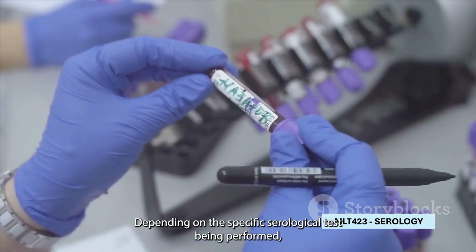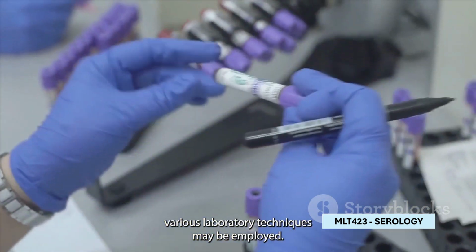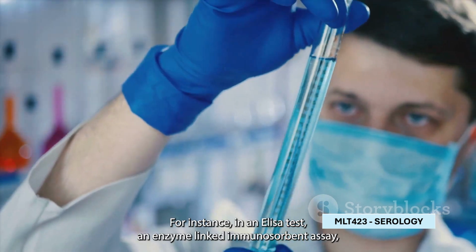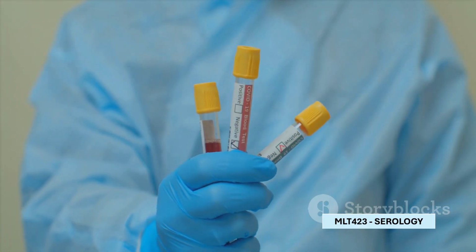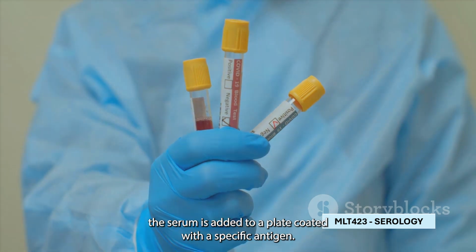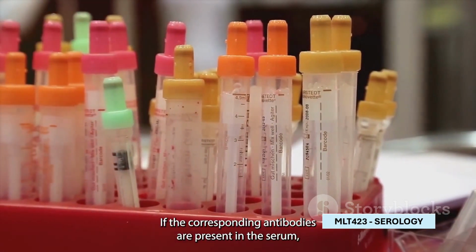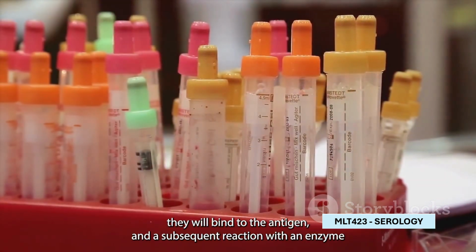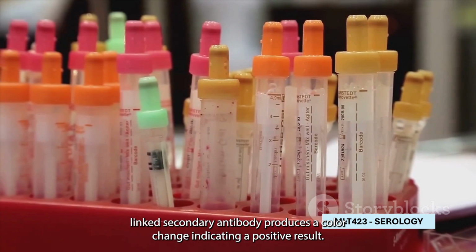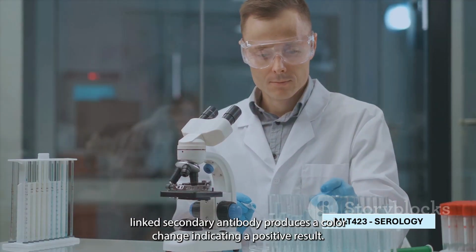Depending on the specific serological test being performed, various laboratory techniques may be employed. For instance, in an ELISA test, an enzyme-linked immunosorbent assay, the serum is added to a plate coated with a specific antigen. If the corresponding antibodies are present in the serum, they will bind to the antigen, and a subsequent reaction with an enzyme-linked secondary antibody produces a color change, indicating a positive result.